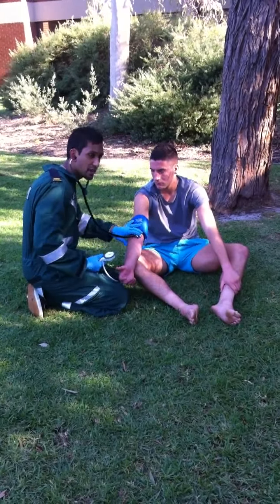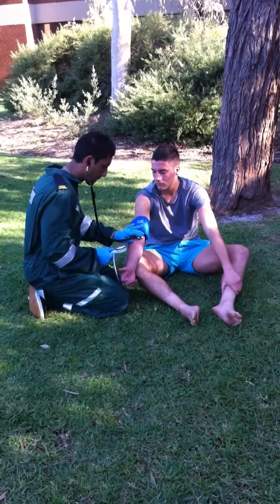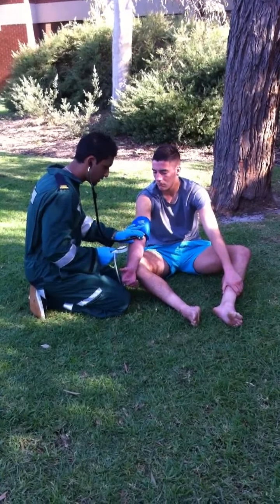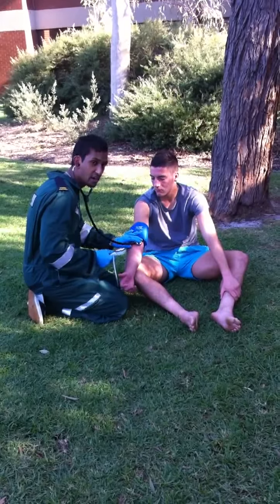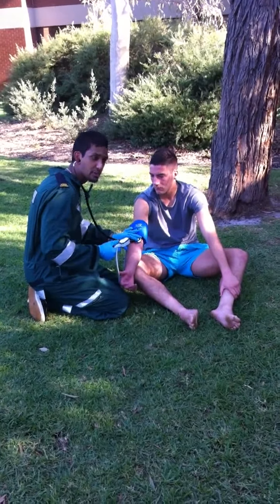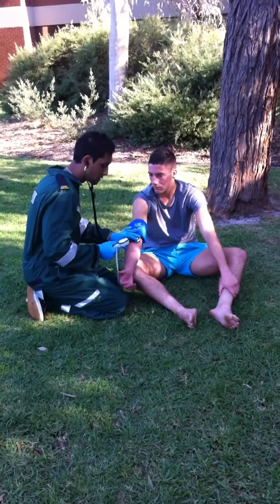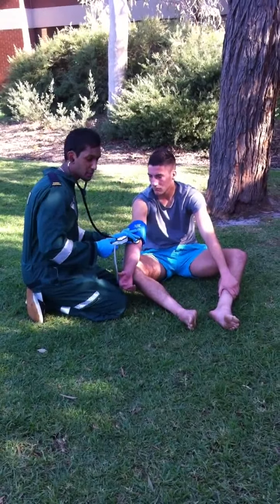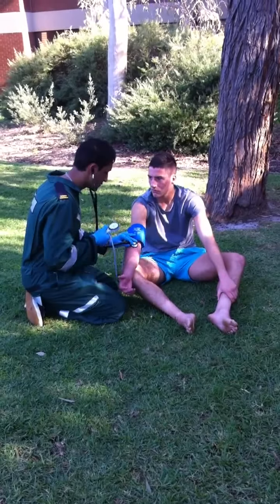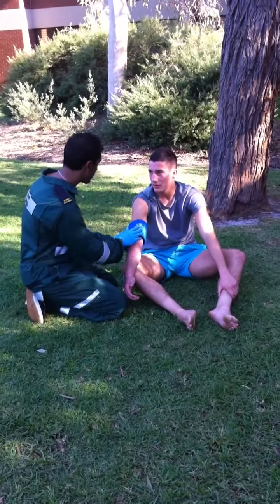I pumped it up to about 30 above the systolic pressure just to get a more accurate reading. As soon as I feel and hear a throbbing sensation, I take the systolic, and when I don't hear it, I take the diastolic reading. So I've got 110 over 78, which is much more accurate than the initial palpating reading. Mr. Jones, that's fine. I've got a reading of 110 over 78. Is that normal? Yeah, sounds about right.